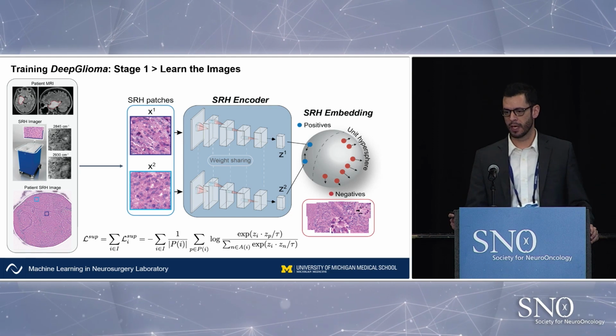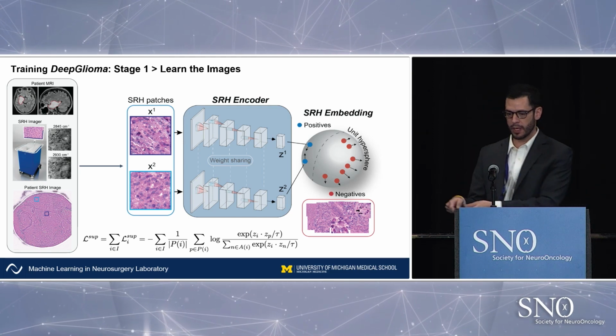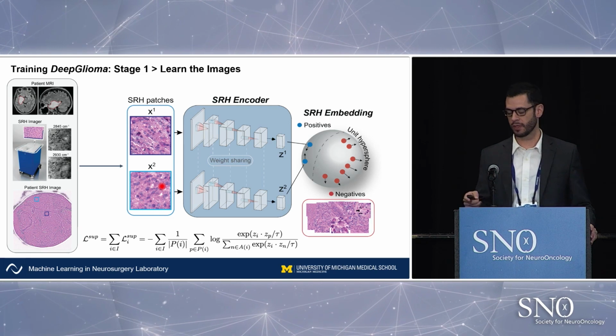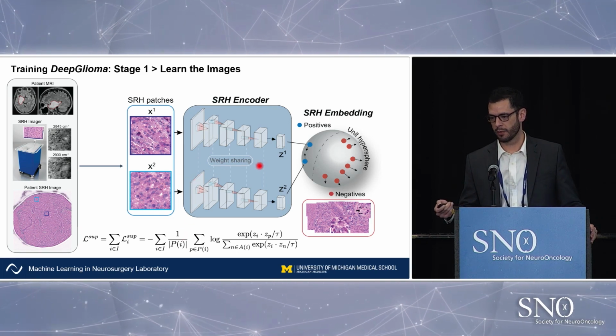How do we train these? Patient comes in, gets a tumor or a biopsy. This is the image that we get in the operating room. And again, these are falsely stained. These are an artificial staining. This is not H&E. But you take two images that have the same molecular genetics. You pass it through a deep neural network here. This is the same deep neural network.